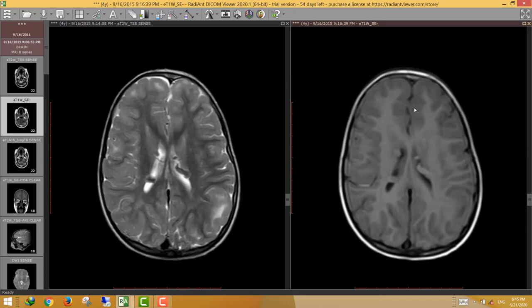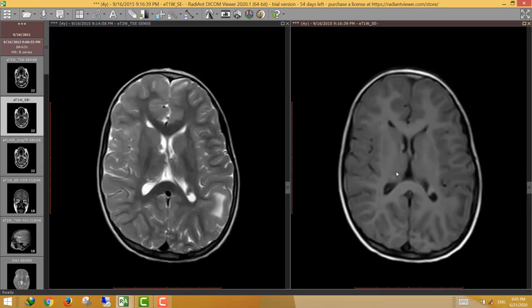This is not gray matter heterotopia, because in heterotopia the nodules are similar in signal to the gray matter, which is not the case here. So these nodules are more likely to be nodules of tuberous sclerosis.